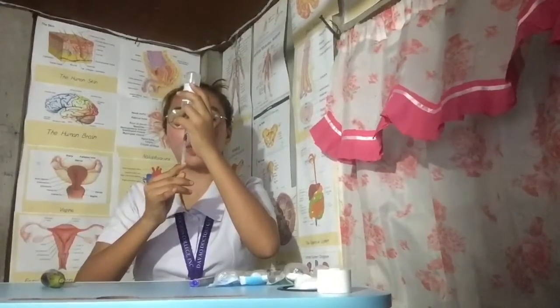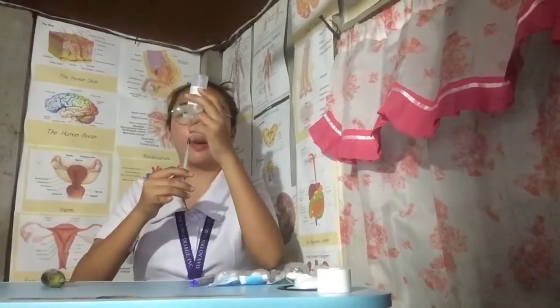And now invert the vial. Ensure the needle tip is below the fluid level and gradually withdraw the medication. If now there is a bubble, let's tip it. Now withdraw it. If there's a bubble, just take it out and replace the cap of the needle.